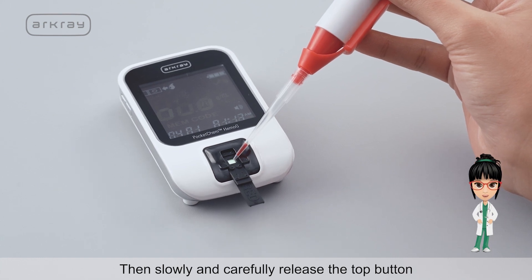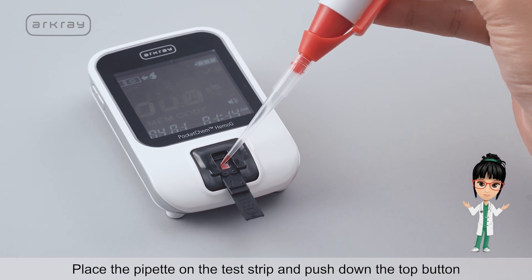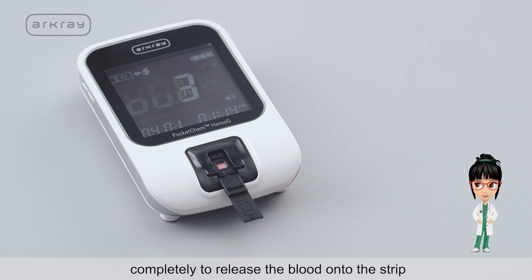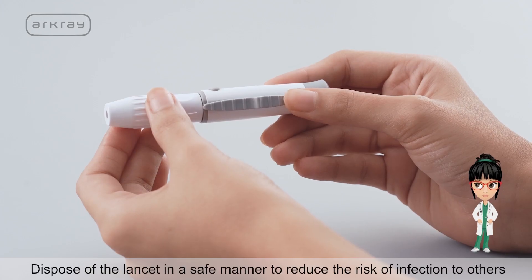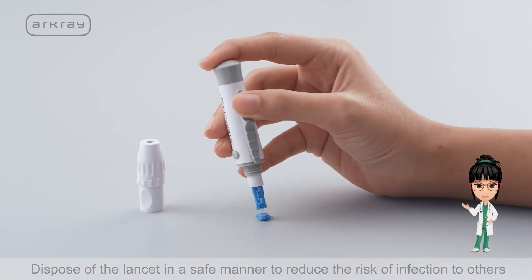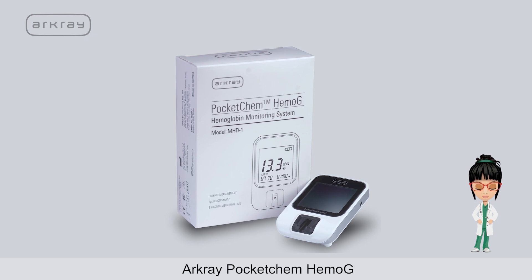Slowly and carefully release the top button of the pipette to draw blood into the tip. Place the pipette on the test strip and push down the top button completely to release the blood onto the strip. At the countdown of 5 seconds, the device will display the hemoglobin and HCT result. Dispose of the lancet safely to reduce the risk of infection. Eject the strip and discard safely. The device automatically shuts off.